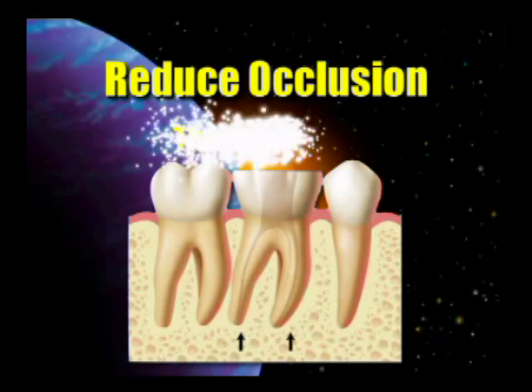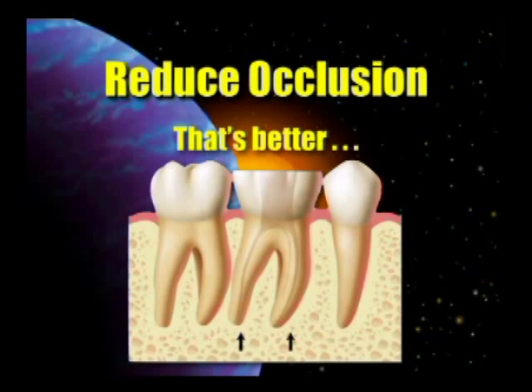But there is some advantage to doing that. If you reduce the occlusion about a couple of millimeters, it guarantees that you'll have no hyperocclusion between appointments. You also will have much better visibility. The light gets into the chamber a lot easier. You don't have to worry about breaking off a cusp between appointments, and the patient never changes their mind and says they don't want to get the root canal. But of course you need to clear that with the patient in advance.